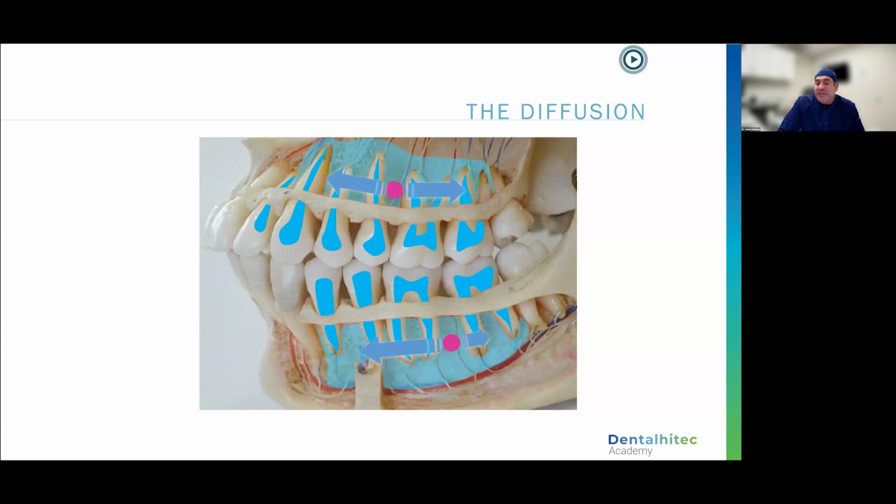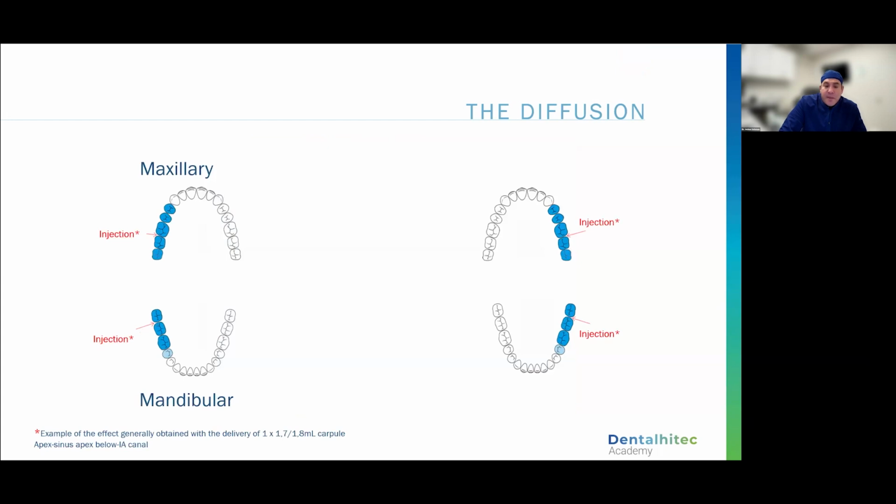But just remember, if this is a teenager with the 9mm needles that we use, don't expect to get this much perfusion. You're likely only going to have profound anesthesia with 2 teeth. The reason for the difference is when we use the 9mm in a child, we're really giving osteocentral delivery. But with a teenager with a 9mm needle, this is really more interseptally. And so you can't guarantee you're going to have this diffusion of flow.